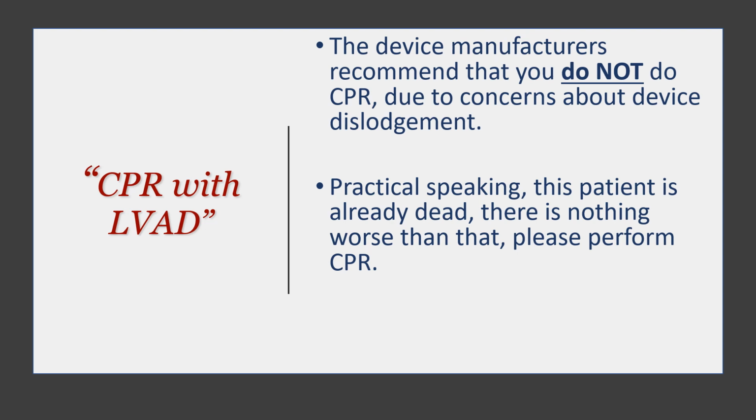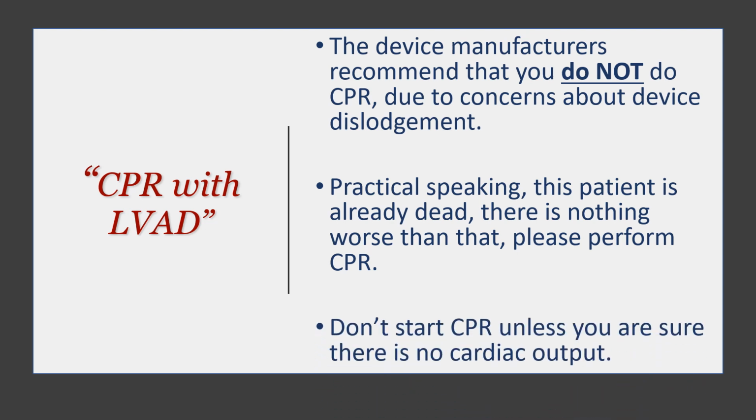The only caveat to this is that you need to make sure first that this patient has no cardiac output rather than no pulse, because normally those patients, they don't have pulse. There are some talks about using abdominal compression versus chest compression for these patients, but I couldn't find enough evidence to support this, so I'm not going to cover this in this talk. We're sticking to just the normal chest compression at the moment.